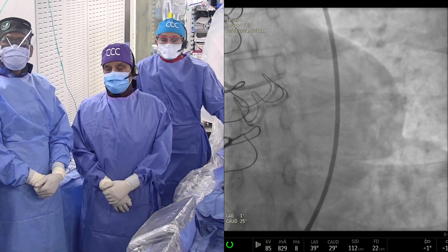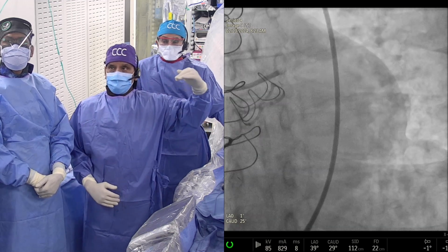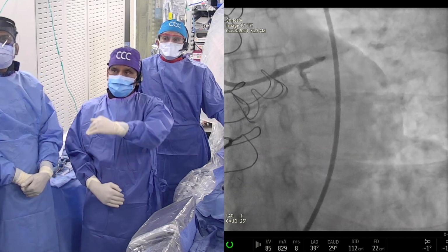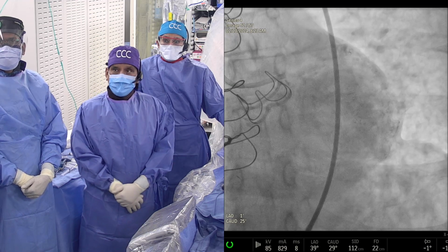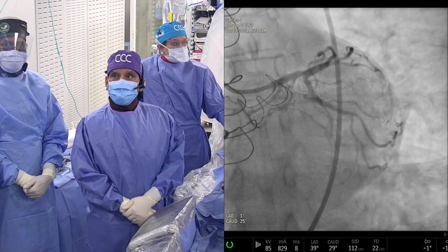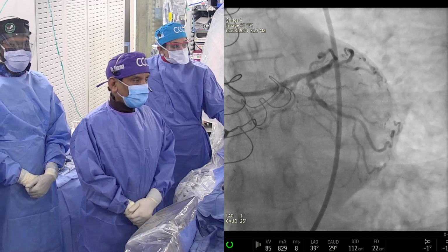But if you are trying to go to the circ, then I can tell you a 2.0 will create a gutter. It will make a parallel lumen right from before the lesion. The wire will be in the vessel wall and create a wire bias situation. So overall it is a 2.0 burr, but if we are going to the LAD. If you're going to the circ, you definitely have to undersize it.